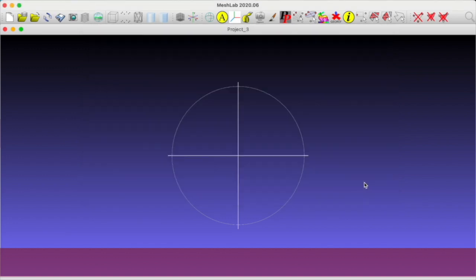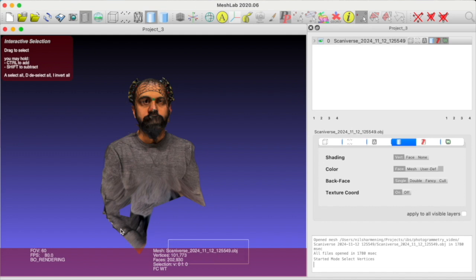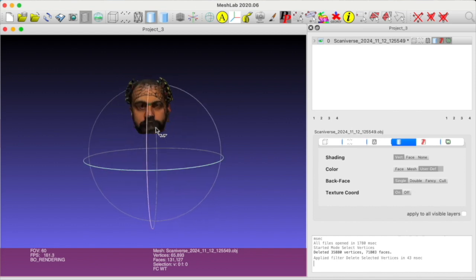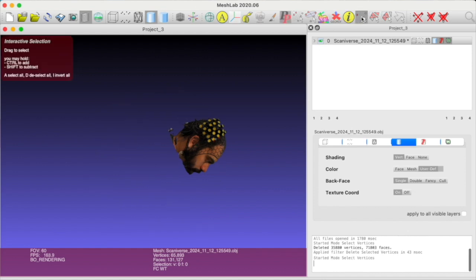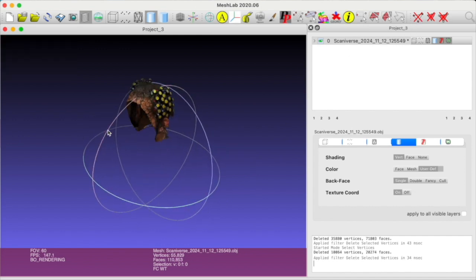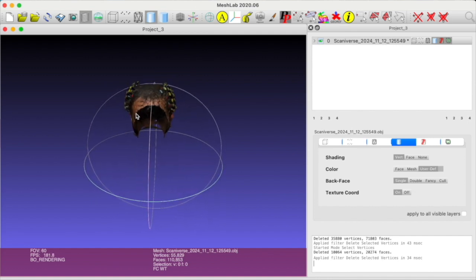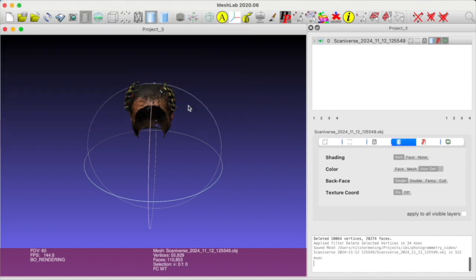So in, for example, MeshLab, an open source software, I load the OBJ and crop the mesh to everything below the head, which we don't need. In case you need to anonymize your final mesh result due to data protection, for example, feel free to cut out the sensitive face regions. The Cedalion automatic optode detection algorithm will still work. Here in my example, I cut out the whole face, but sometimes you still need Nasion in your final OBJ, so then only crop around it and you're still having an anonymized mesh.